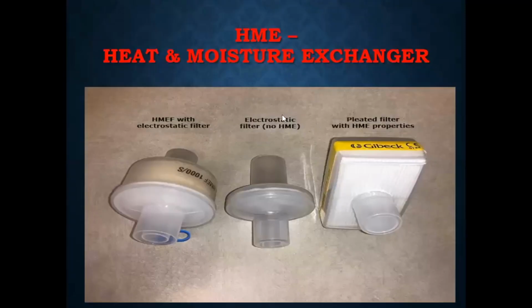Okay, next we go to HME. Five minutes, then we stop and go to the next topic. HME is heat and moisture exchanger. So this is the HME. When you see HME alone, this is the HME.